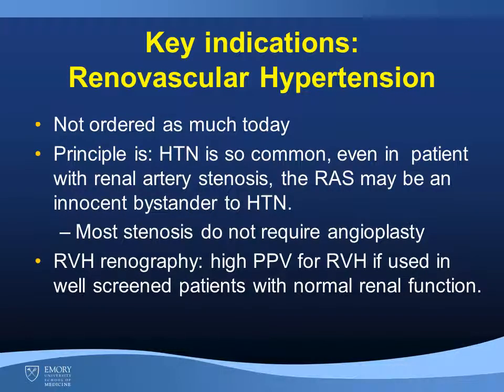So we're going to move on to another key indication, and that's looking for renovascular hypertension. Now, this study is not ordered as much today, but it is worth reviewing since occasionally this can be performed, and understanding these principles helps you also understand basic renal physiology.